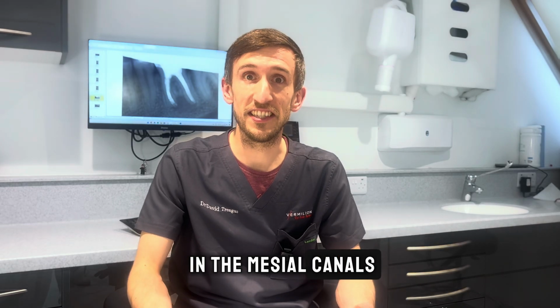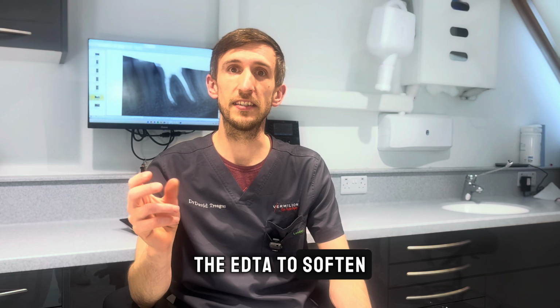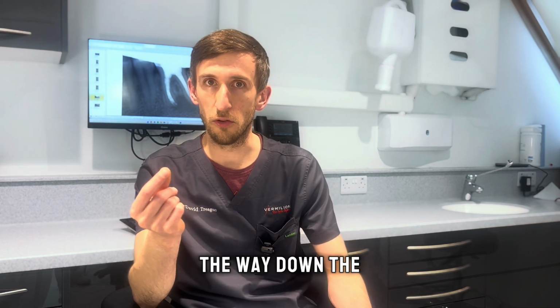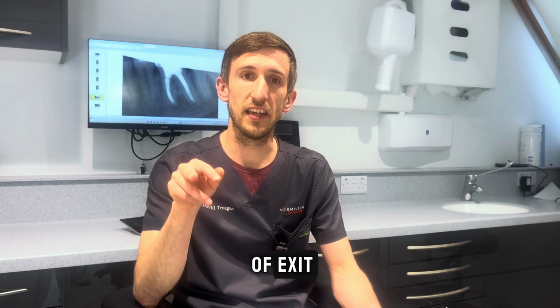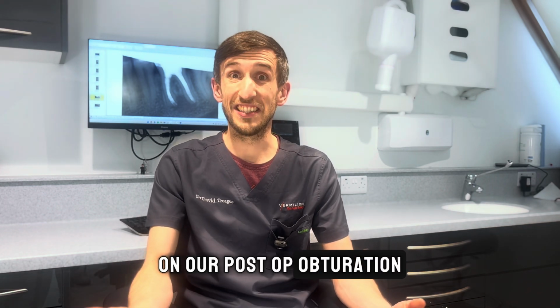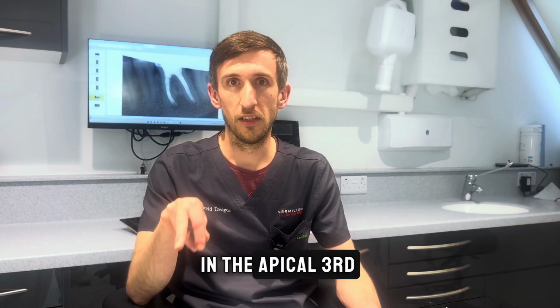To gain patency in the mesial canals, I used a combination of C+ files and EDTA. The EDTA to soften the dentine, and the C+ files with their cutting tip, they work their way down the canal system inside that tooth. I could actually feel that there were 2 portals of exit in the apical third of this tooth. Although that wasn't clear on the cone beam CT scan, on our post-op obturation you can see this quite clearly, where the canals do split off into 2 canals in the apical third.